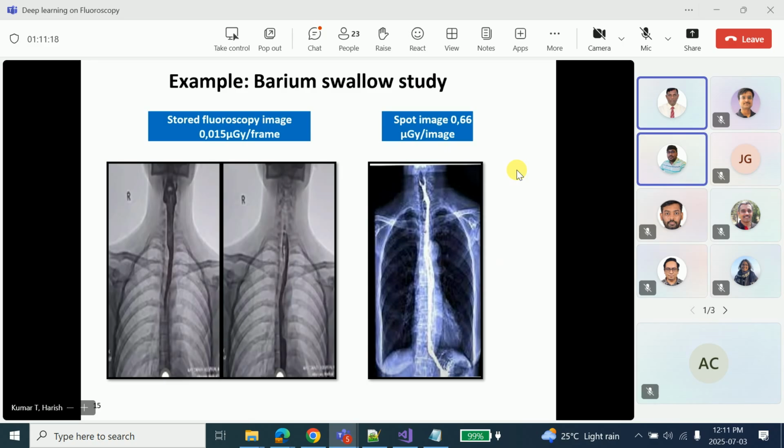It's the flow. What you're swallowing, and when injecting, that's how angiograms are done. As the dye goes into the artery, you're able to see it live, and you're able to appreciate whether you have a thrombus, an occlusion, a stenosis, or a clot. That's how you find out.